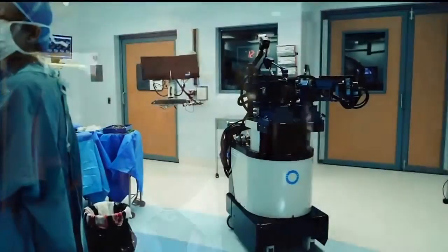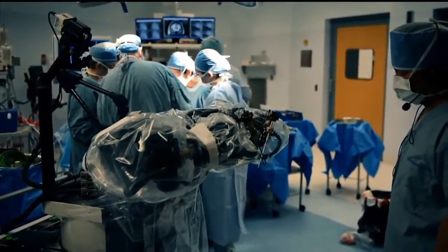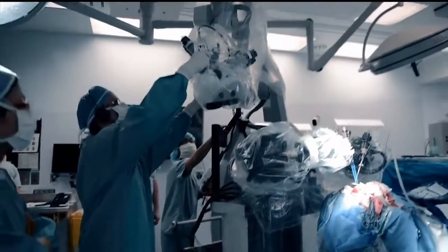What would have been her prognosis had you not been able to use that? In these particular cases, her prognosis would have been pretty good using conventional surgical technique, but we're trying to show that with machines and surgeons, we will always deliver an excellent outcome. So that might say I would like the bar to be raised. The other thing about machines, like a robot in an operating room, is that all the data is digital. So everything is recorded, and people can play back and learn from that procedure. In theory, they can also play forward, which is one of the goals of the project: to feed your MR imaging data into the robot's workstation and practice your surgery before you actually do it.